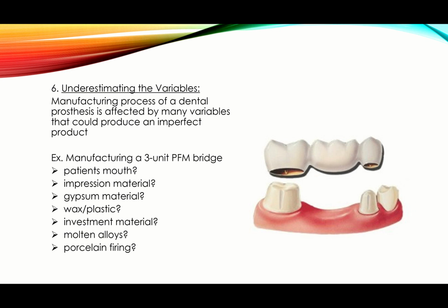It's true that after 45 minutes or after 1 hour, the percentage of expansion is very minimal, but it exists. I want you to know that it does exist. So in other words, after final set, which is say 1 hour, working on the model is a bit more accurate than working on the model Monday, if you poured it Friday and didn't work on it Saturday, Sunday, and then worked on it Monday. So that's a variable too, and there's expansion in all gypsum materials.